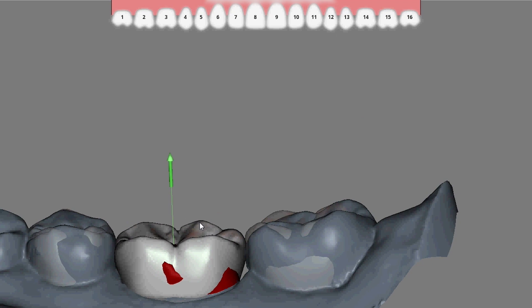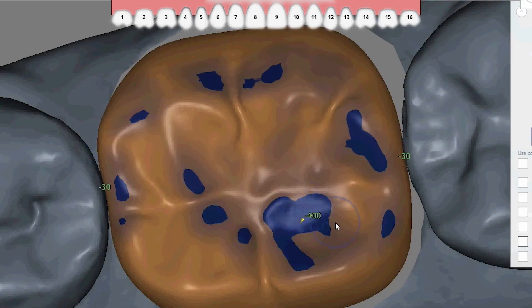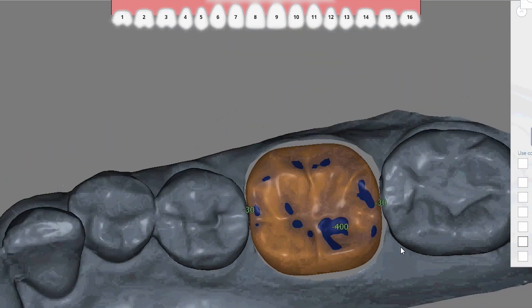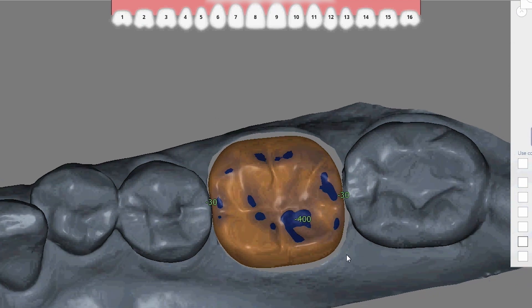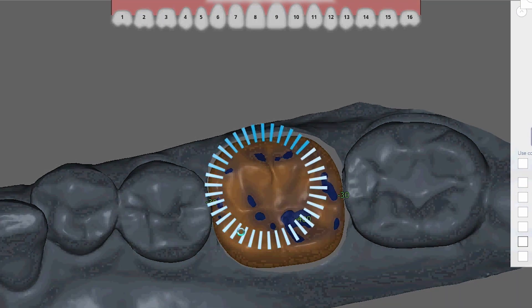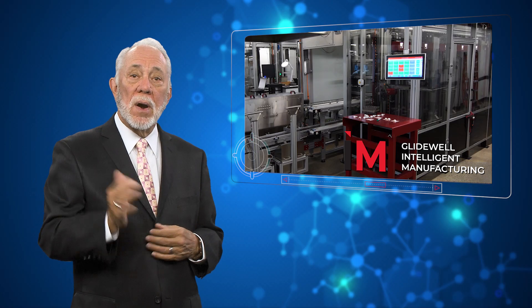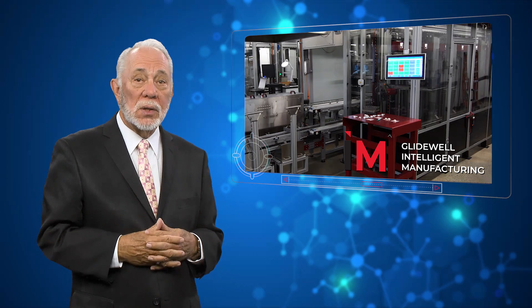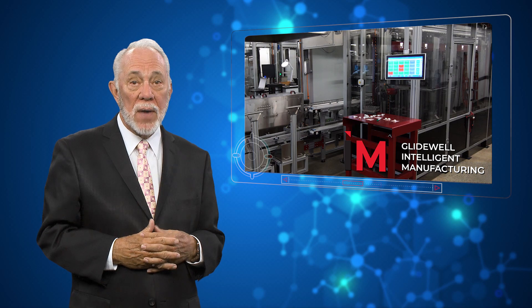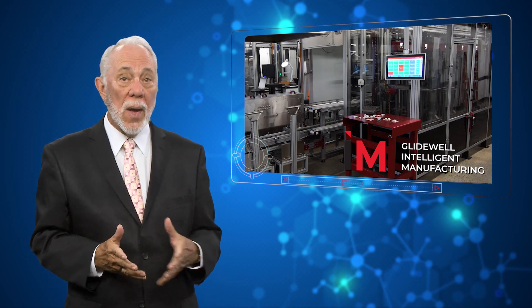With our virtual study model, we're ready to design the restoration. Initial designs are automatically proposed by a proprietary software that makes use of machine learning algorithms derived from millions of unique cases and considers the morphology of the patient's surrounding dentition. From there, the technician can quickly accept or modify the design as needed, further teaching the software along the way.